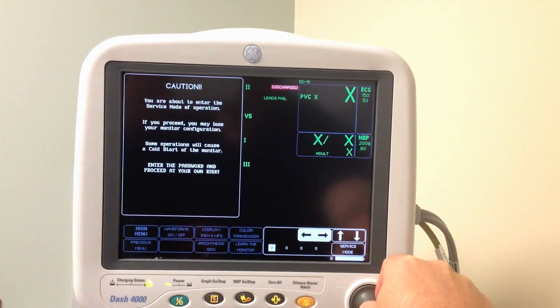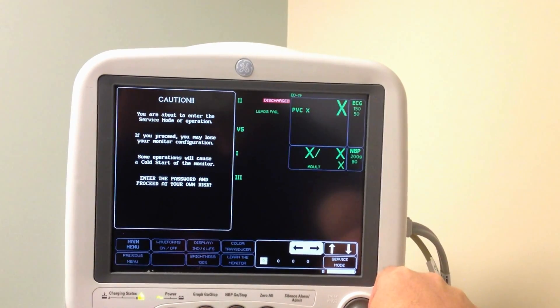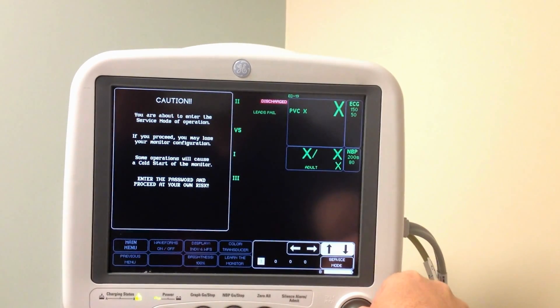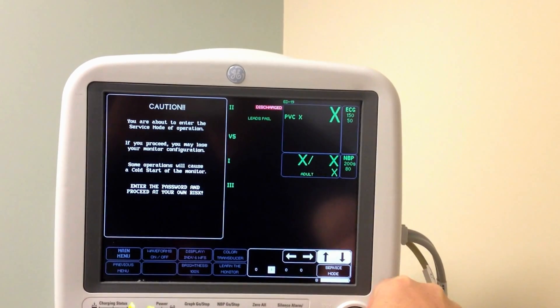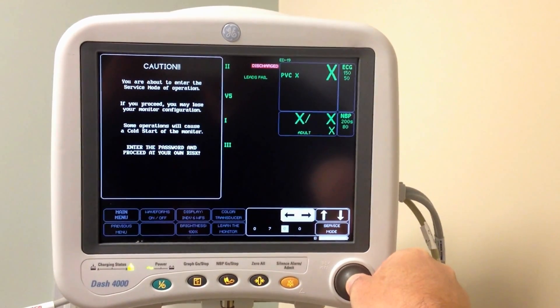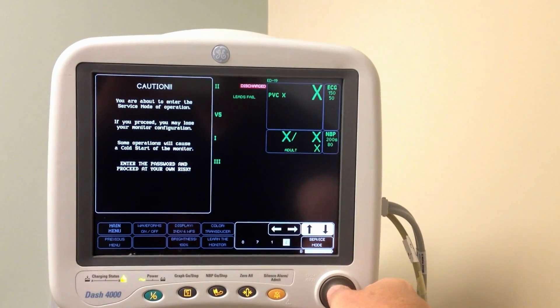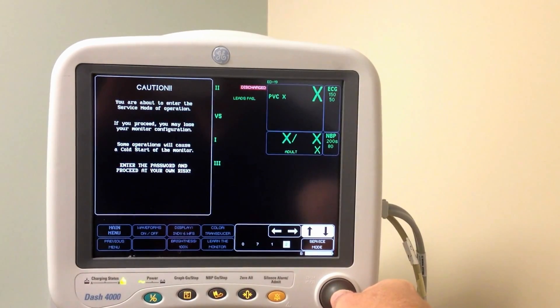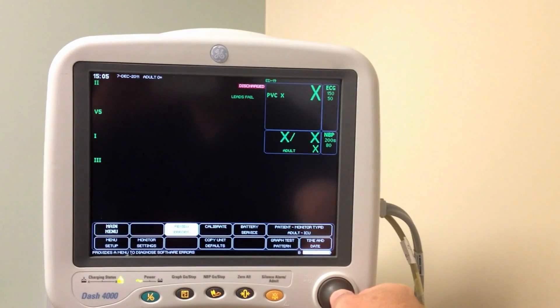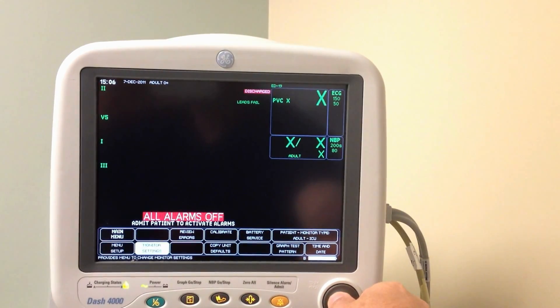And today is the seventh day of December — 0, 7, 1, 2 — for December 7th. And now we are in service mode.